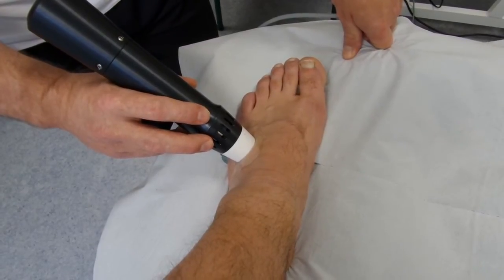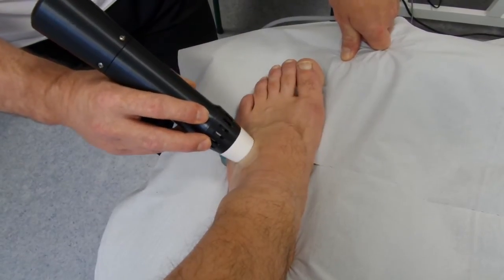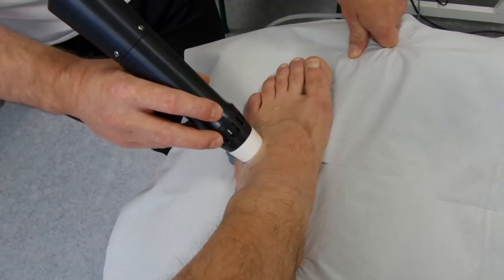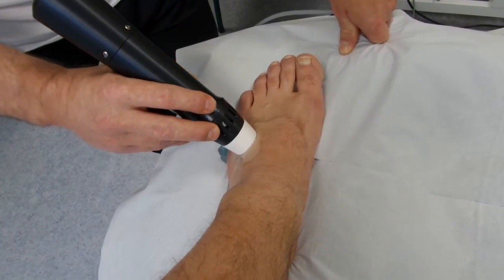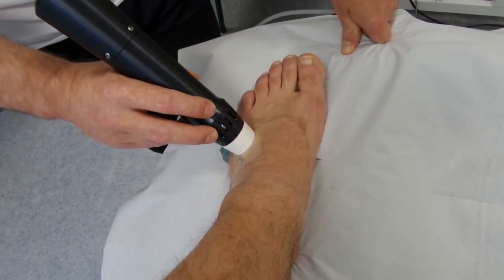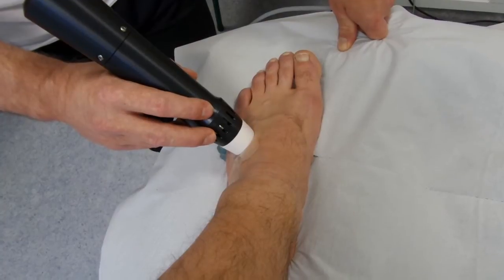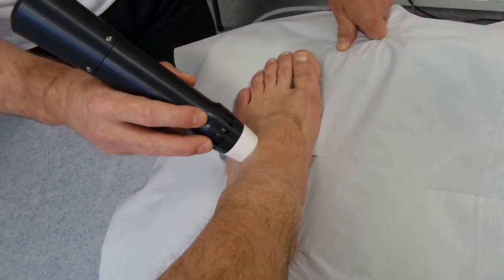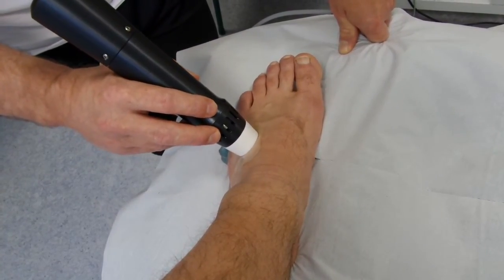This patient had significant symptoms in his foot. He's a strong man who developed foot symptoms from doing a 400 kilo super yoke carry — almost a jog — which may seem unfathomable to most people, but not to strongmen. He's irritated the bursa in between his metatarsals and we're trying to address that.